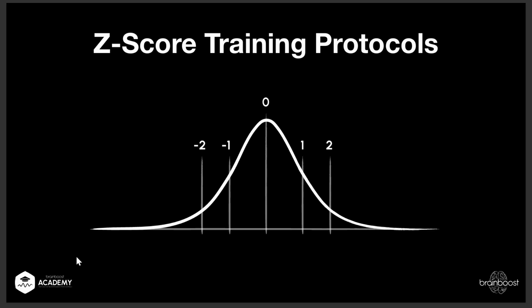So today's topic is Z-score training protocols. There's a prior webinar where we talked about Z-score generally, Z-score analysis, and this webinar is about using Z-scores to train a brain.